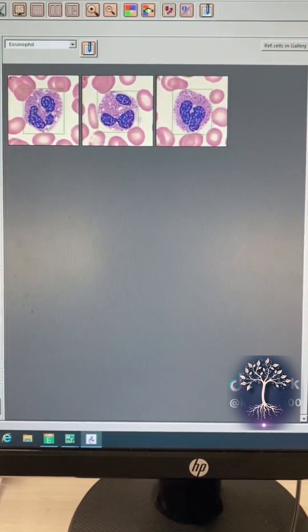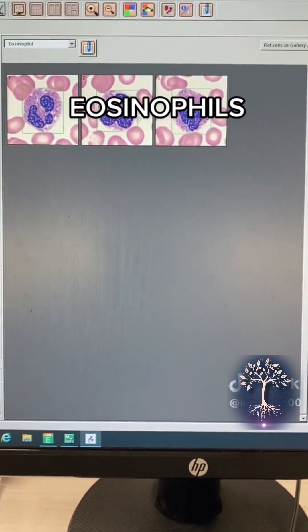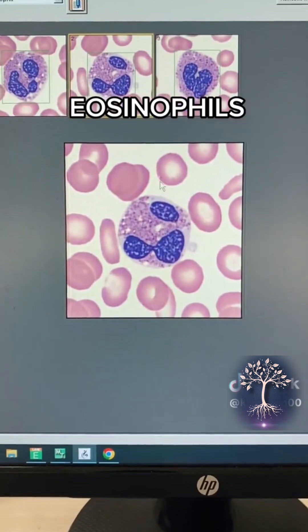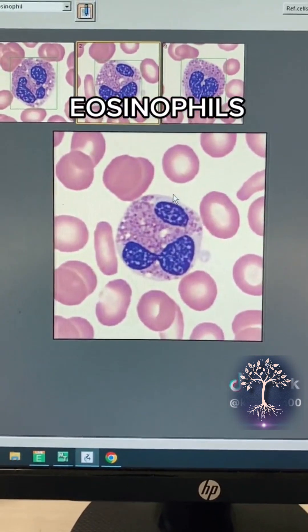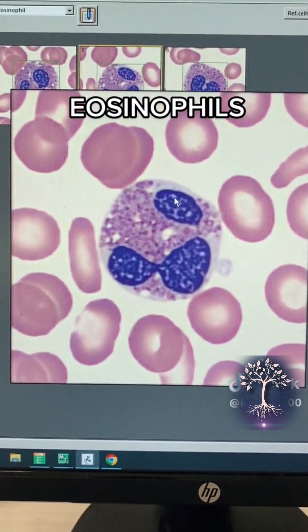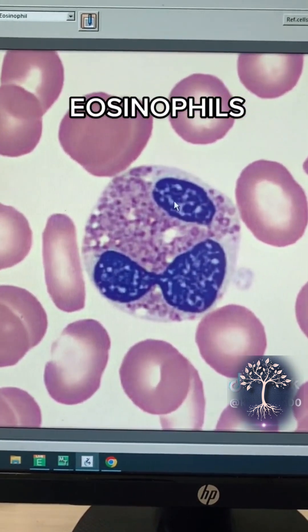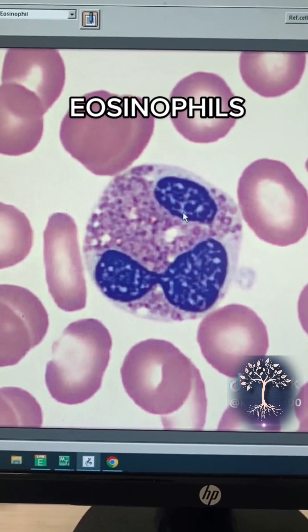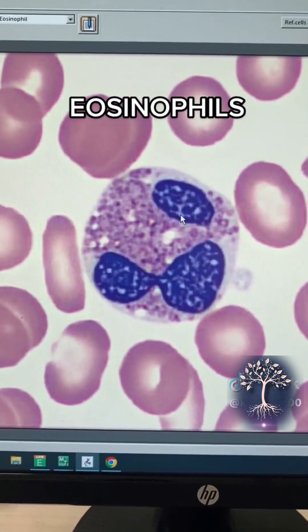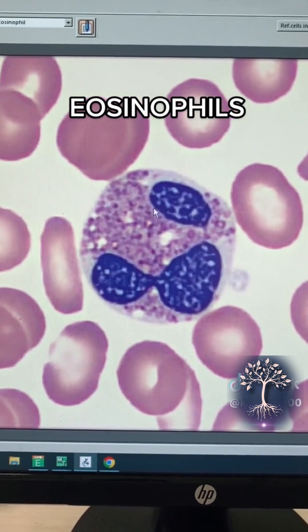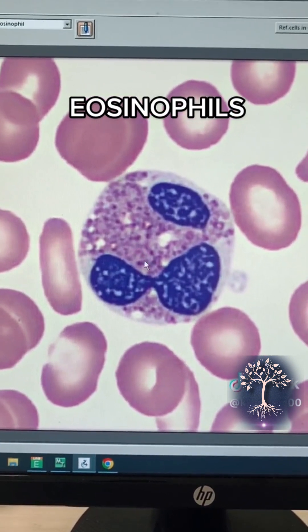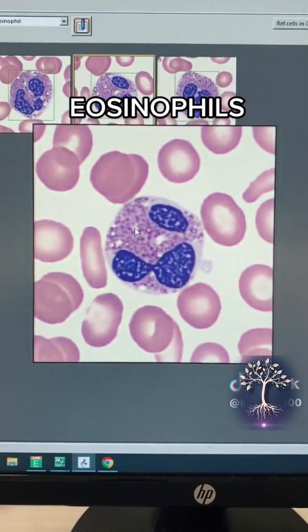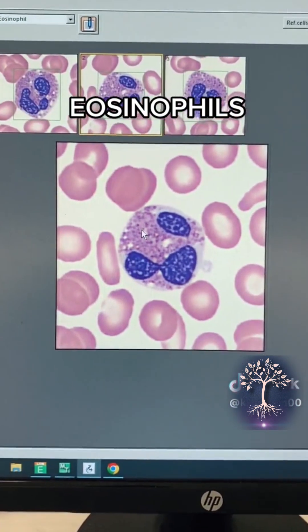Next we have the eosinophil, which is personally my favorite just because I think it's pretty. It has this really pretty pinkish-purple cytoplasm which contains enzymes and proteins — it's all clumped and clustered — and then it has a dark purple nucleus.